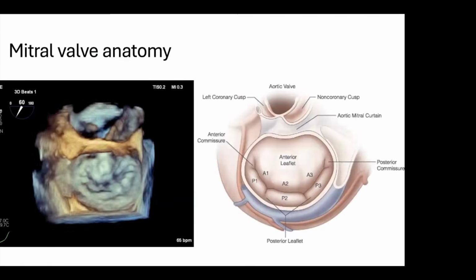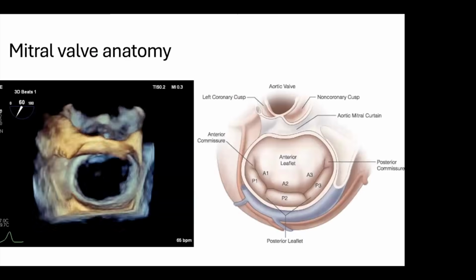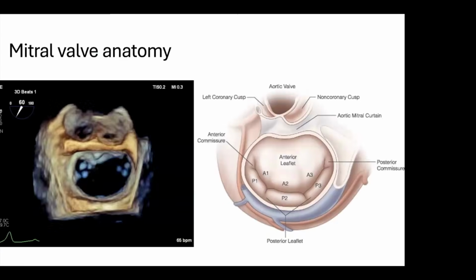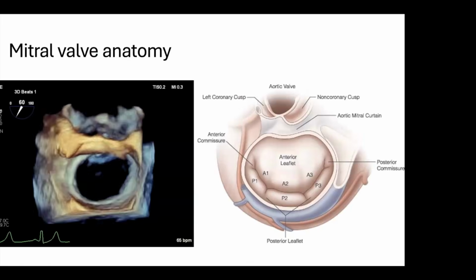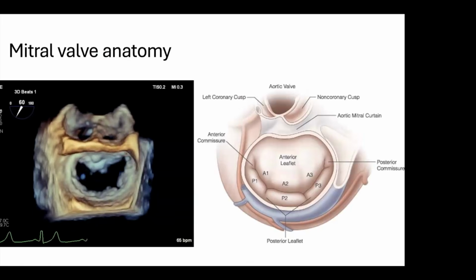We're going to be talking about the mitral valve a lot. I think it's a valve that's easier to understand. There's a lot of interesting pathology associated with it. So, just for today, we're going to be seeing a lot of the mitral valve.